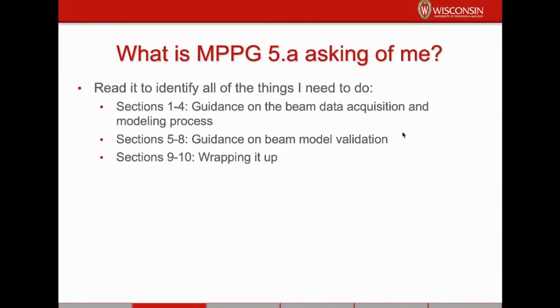As I went through, I kind of made a checklist of all the things that I might want to do. In reading sections 1 through 4, there was guidance on beam data acquisition and the modeling process. I found that we have a pretty good commissioning plan as far as beam data acquisition and modeling is concerned. I think we're already doing all of these best practices, so I thought I didn't need to focus as much on this area.